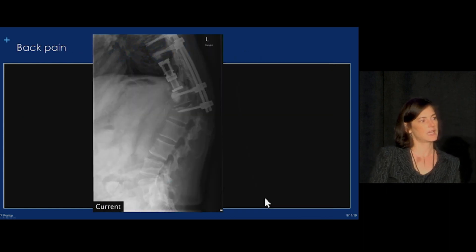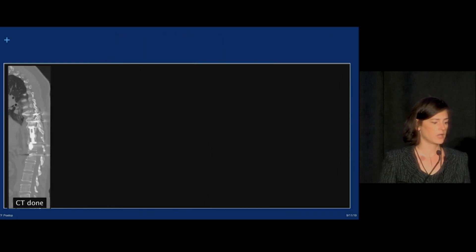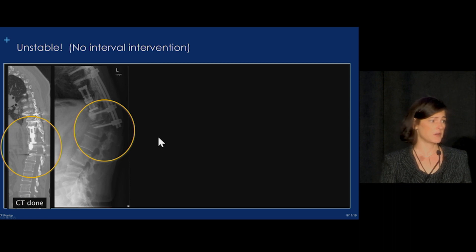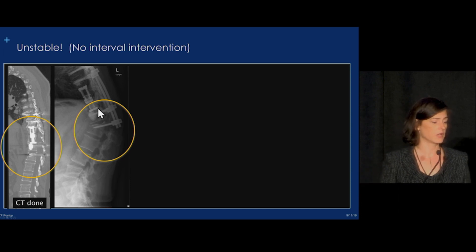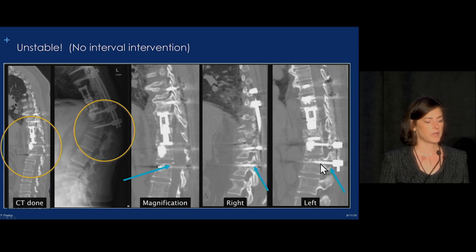Here's another patient with back pain after fusion. There's junctional kyphosis, and looking back at the first study confirms this developed over a six-week interval. On CT, all the hardware is present, but there's a big change in alignment with no interval intervention — indicating a very unstable spine. The CT shows why: a fracture line involving the vertebral body extending along the pedicle and involving the pars interarticularis on both sides. This is a very unstable fracture.